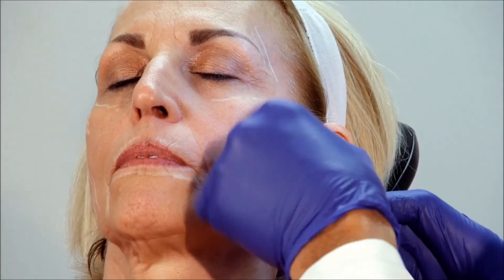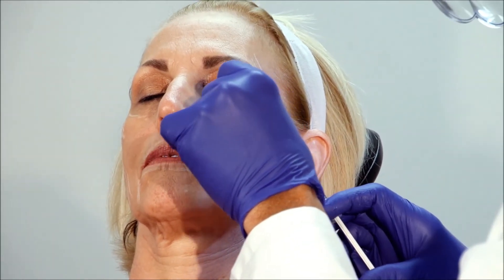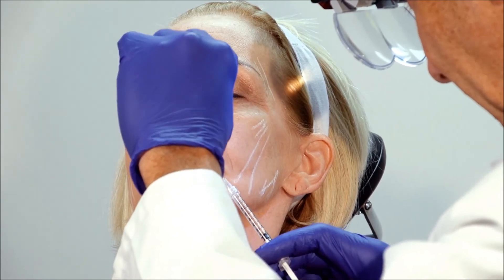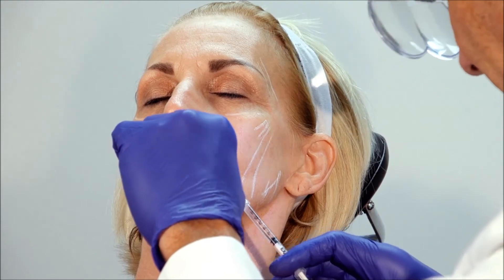This technique of lifting the tissue up and letting it fall onto the tip of the needle is a good technique for lessening discomfort, because the brain is going, 'What's going on? Why is he lifting my skin?' And then it drops down onto the needle — it just makes it less painful.